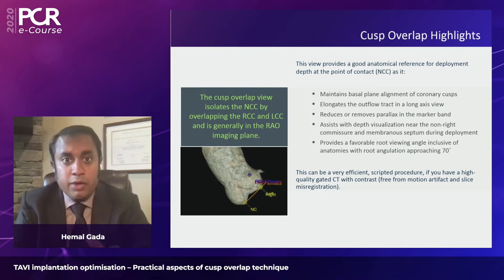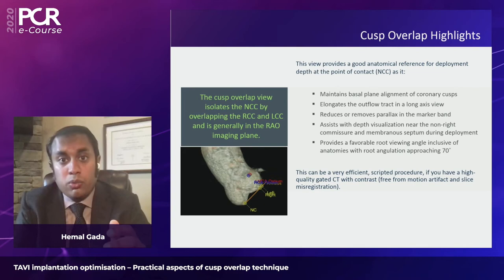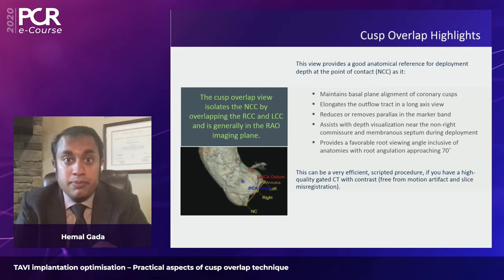We overlap the right and left coronary cusps, leaving the non-coronary cusp independent. This morphs the three-dimensional structure into two dimensions, giving a more valid and reliable visualization of the true insertion of the non-coronary cusp. This elongates the outflow tract and provides a clear representation of depth relative to the non-right commissure and the conduction system below. Additionally, the stiff wire parks itself at the apex of the non-right commissure.